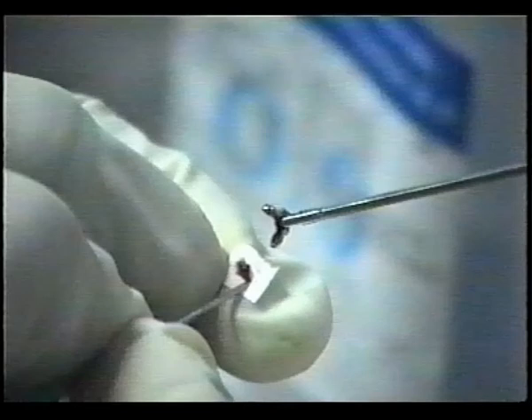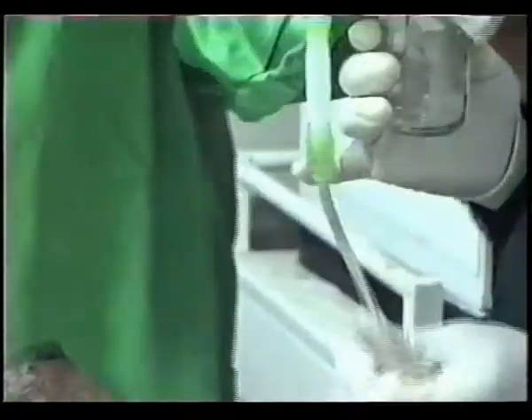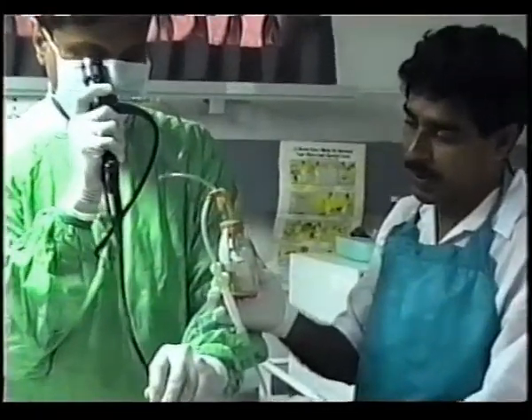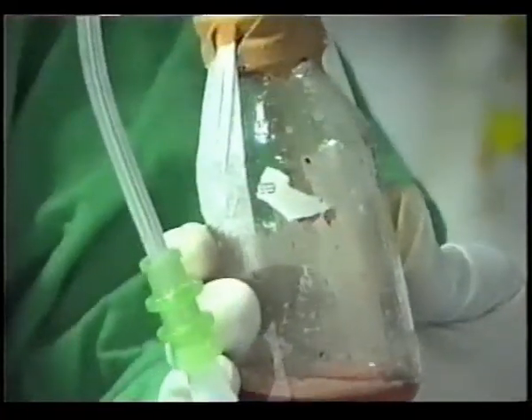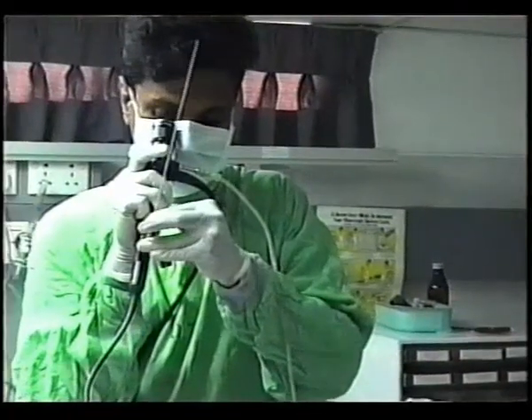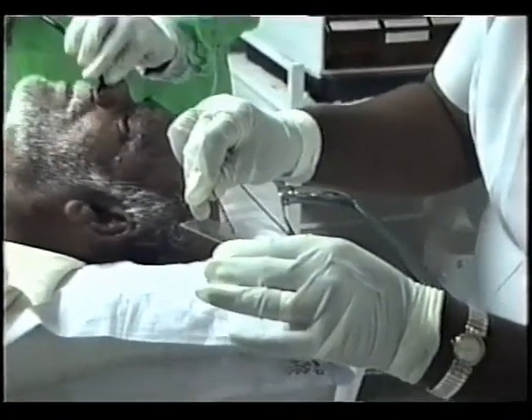A bronchial biopsy. Saline is instilled through the bronchoscope into the bronchial tree and washings are obtained. Washings are sent for cytology. This is a bronchial brush smear.